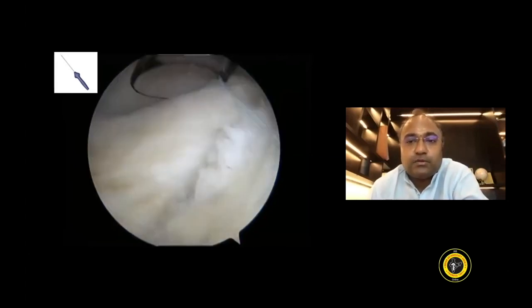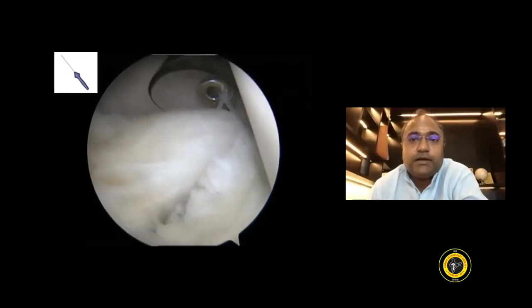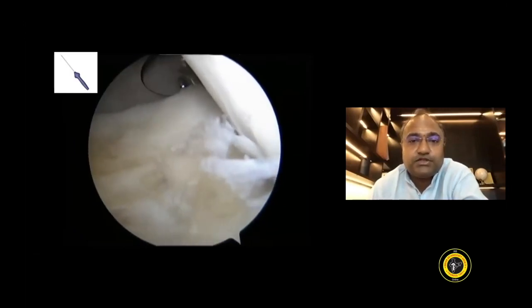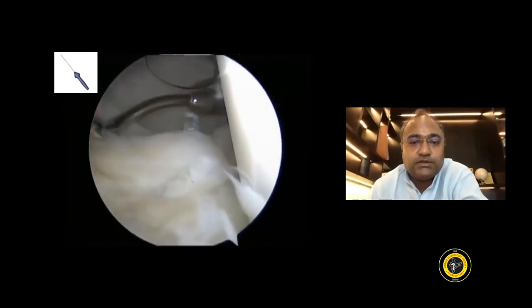Retrieve the suture from the cannula and tie a knot. Preferably tie multiple half hitches kind of a knot. Do not use a sliding knot so that there is minimal abrasion of the meniscal and the capsular tissue. You start from the medial side and then keep progressing towards the midline.